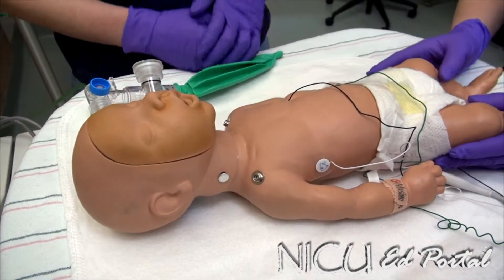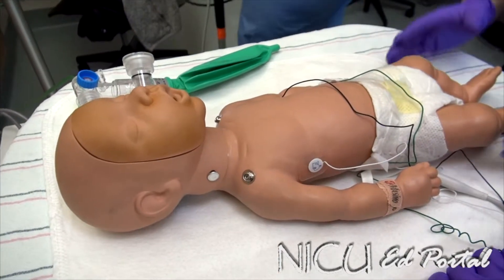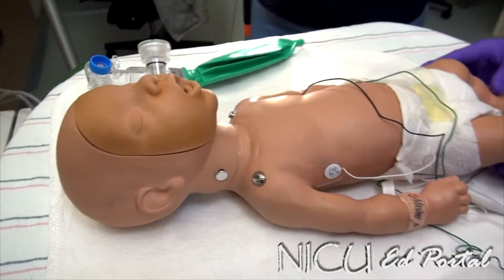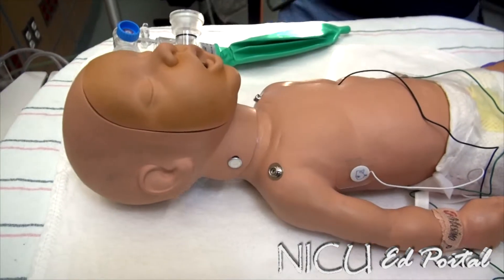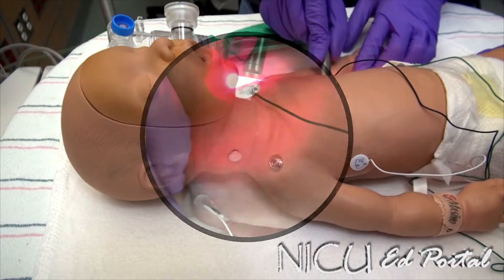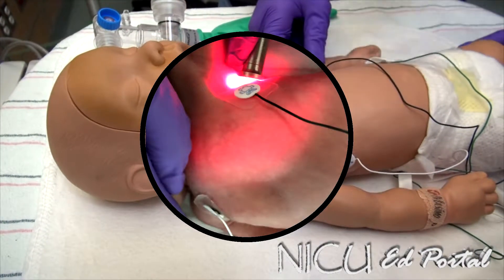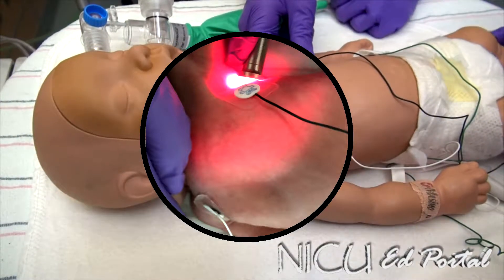The next thing we can do is transilluminate the chest. If we're concerned about the left side, we'll take the transilluminator and place it in the axilla, and then we'll see the entire left side light up if there's a pneumothorax.